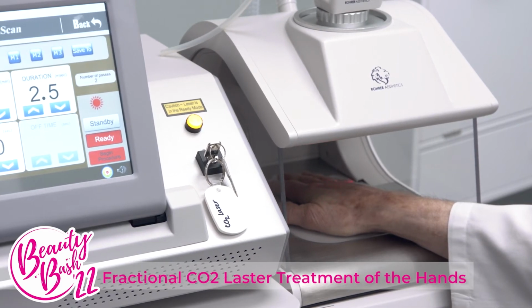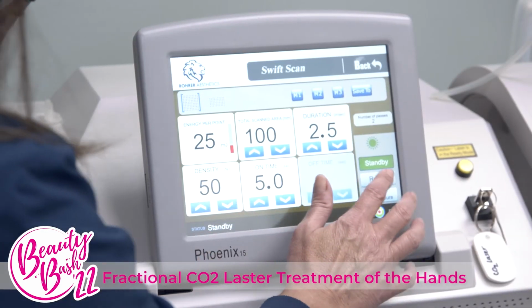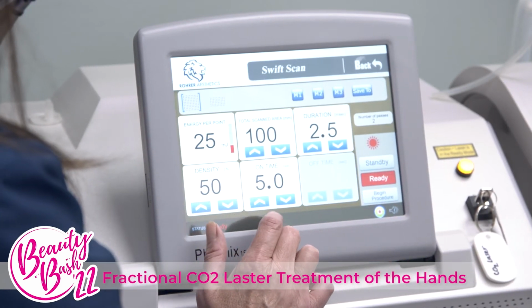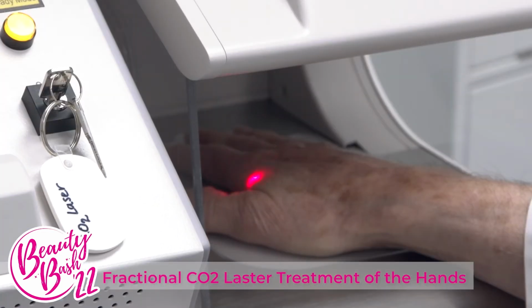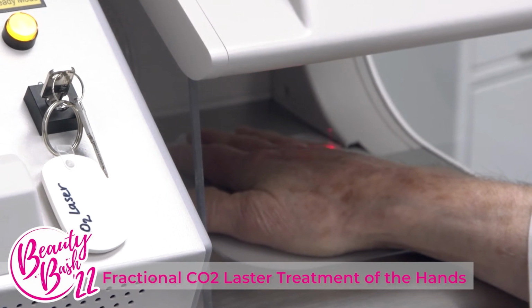As sun-damaged hands are a big problem in our patient population, the parameters for treatment are set up automatically so that the operator needs only to decide whether to do 1, 2, or 3 passes. The number of passes will alter the percent of the skin that receives the laser pulse. The greater the number of pulses, the quicker the final results will be achieved, but more pulses also mean a slightly longer healing time. The operator and the patient together can decide how aggressively each application should be done. The treatment is almost painless and requires no anesthesia.